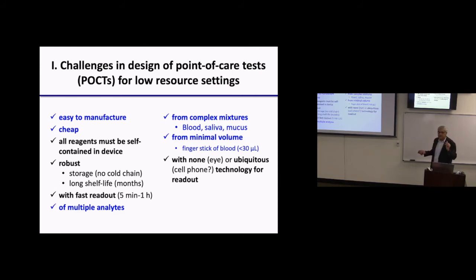In our case, the largest cost of manufacturing is the cost of the antibodies because we buy them in very small volumes from suppliers. Once you start making your antibodies, the cost drops to nothing because you're inkjet printing picoliter volumes. So even when I buy an antibody for hundreds of dollars and I get like 100 microliters or 10 microliters, I can make many chips. And I'm paying enormously exorbitant prices for it from R&D Systems and Santa Cruz and so on. If you make it, you can make 5 grams per liter of antibodies these days. I mean, the technology is there because antibodies are drugs. The drug industry's figured it out.